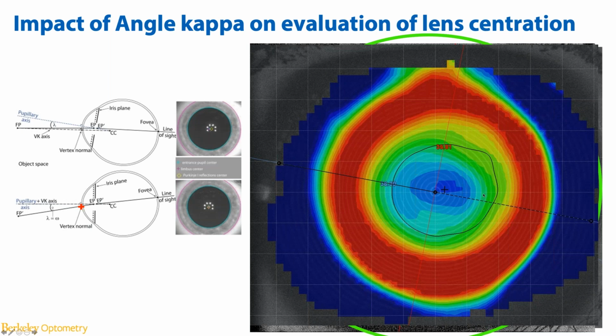So even within this treatment area, we're getting a lot of positive spherical aberration. And also in terms of the paracentral steepening, there are actually at least 3 components at play. Number one is the amount of paracentral steepening we're seeing, whether this is a 2 diopter, 4 diopter, 8 diopter. Number two is the width of this paracentral steepening. Currently, we don't know if a narrower but more dramatic paracentral steepening works better than a wider but less dramatic paracentral steepening. And the third component is related to the size of the treatment zone, which is the location of the paracentral steepening.